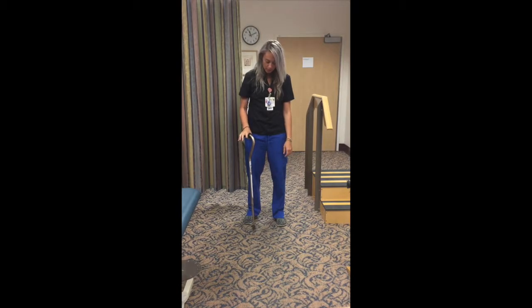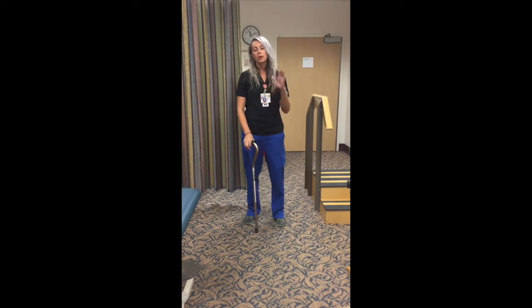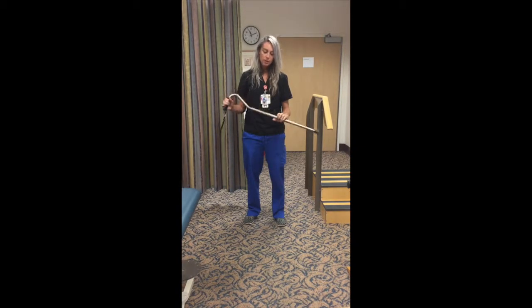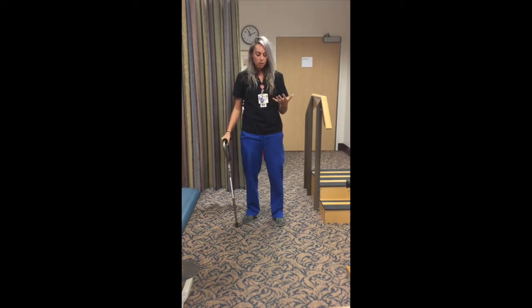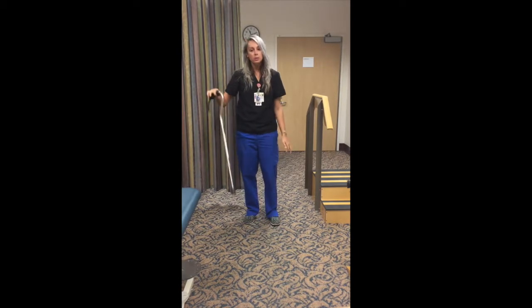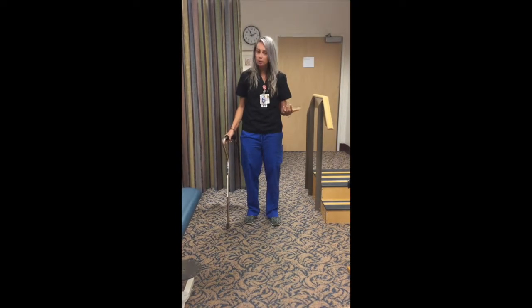Okay. Now, when you're transitioning to the cane, the most important thing is knowing what side of the body to hold it on. It's the most common mistake we see with anyone who's using a cane, and it's very easily correctable. The biggest thing is making sure you're holding the cane on the opposite side of pain or the opposite side of surgery. So if I had a left-sided hip or knee replacement, I'm going to be holding the cane on my right side.